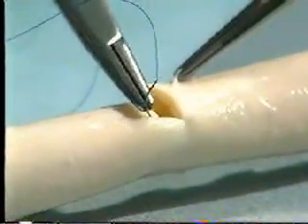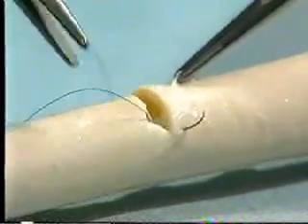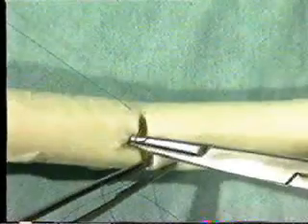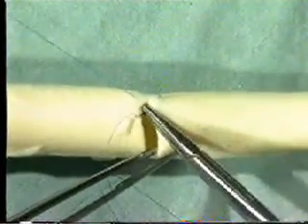This allows stitching to begin in both corners of the incision and avoids the final suture being placed at the end of the arteriotomy. Commence at one end of the incision, passing both needles from inside to out.